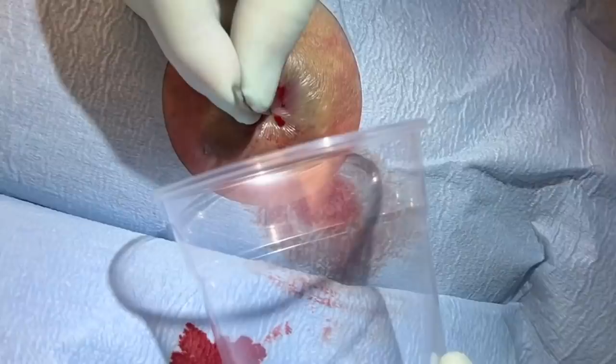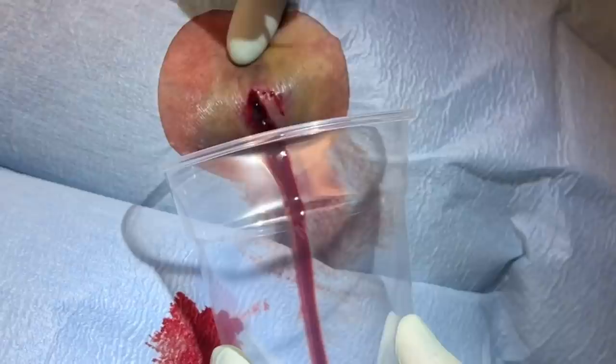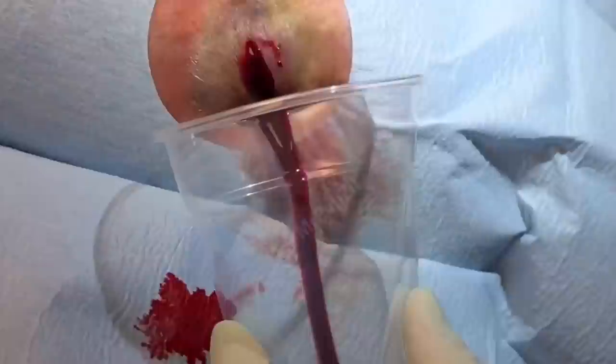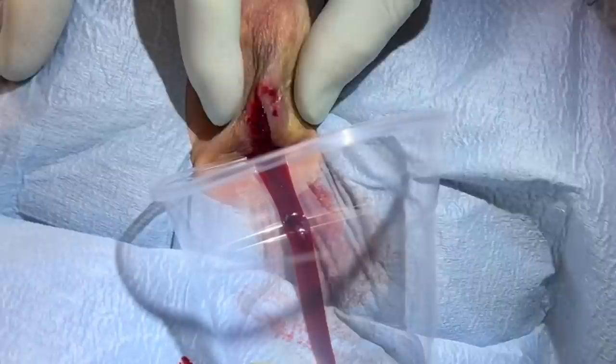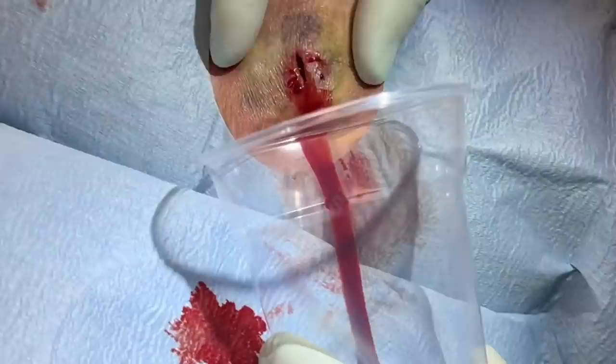Let me know if you have any pain. So we are seeing a lot of coagulated blood there. And that is deflating. There are a little bit of clots and I saw a couple of cyst material in there.